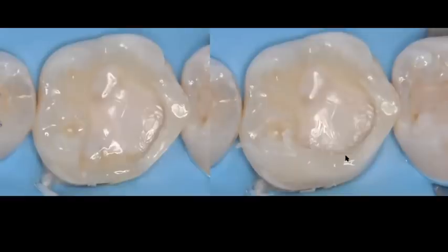So now what I have done is transformed this class 2 preparation into a class 1 restoration, because now I have a buccal wall that I don't have to worry about. This buccal wall, this enamel or dentin layer of composite, is so thin that the light is going to go through and through. It has very little adhesive or bonded wall, which means that you're going to have a lot of free surface within that composite to relieve any stress buildup that is happening while you are polymerizing.